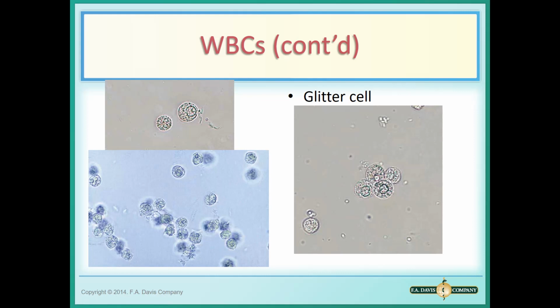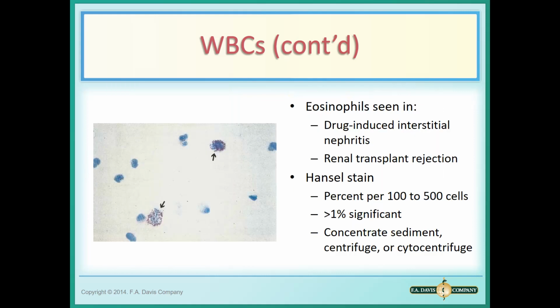We use a small aliquot or sampling of it. Number one, we don't want to destroy the original sample. And number two, we can't do the full microscopic analysis based on that because that acetic acid is going to hemolyze all the red blood cells.